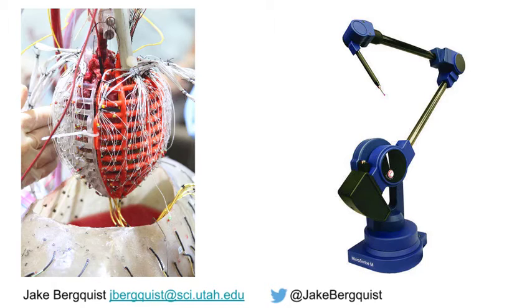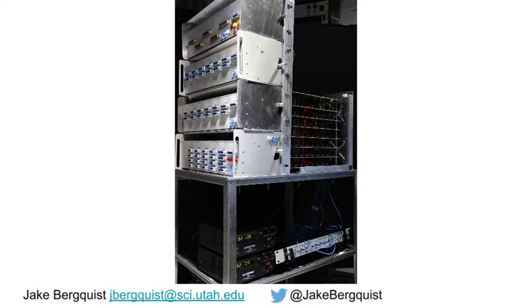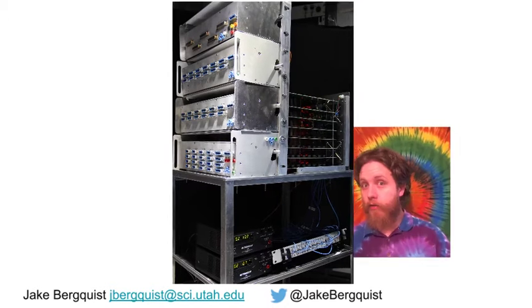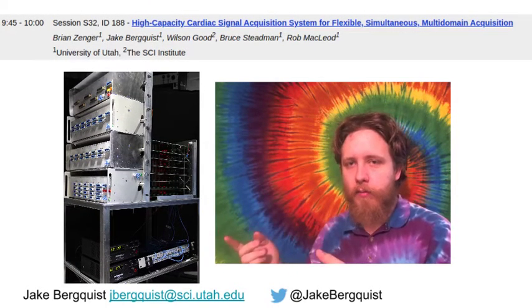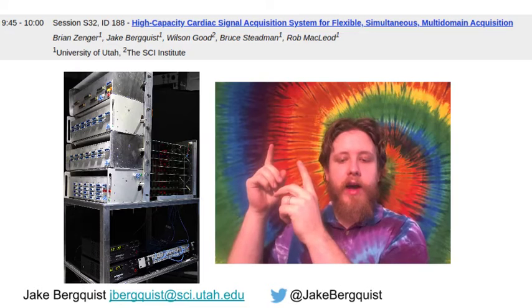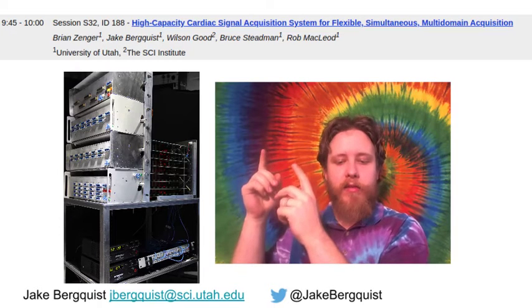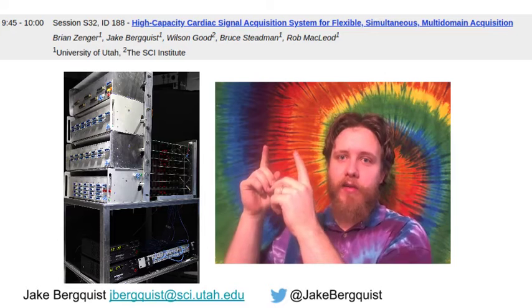To control for errors in the signals that we acquire, we rely on good grounding practices and a custom acquisition system that allows us to record simultaneously all of our electrode signals as well as reference and ground signals. If you're interested in hearing more about our new experimental signal acquisition system, then go check out Brian Zenger's talk at the end of this session titled High Capacity Signal Acquisition System for Flexible Simultaneous Multi-Domain Acquisition.